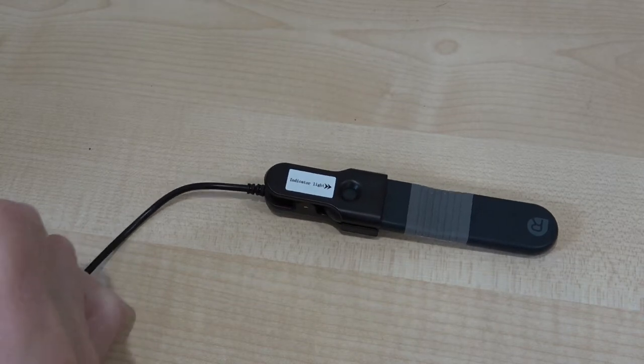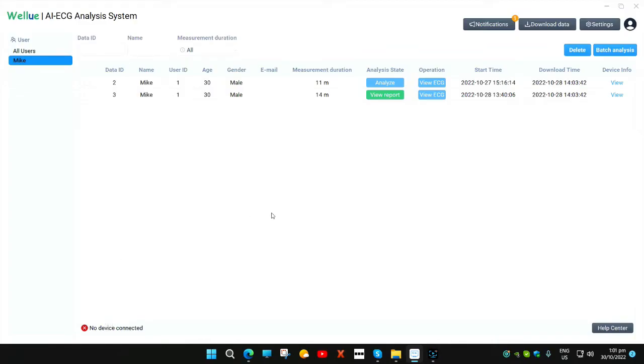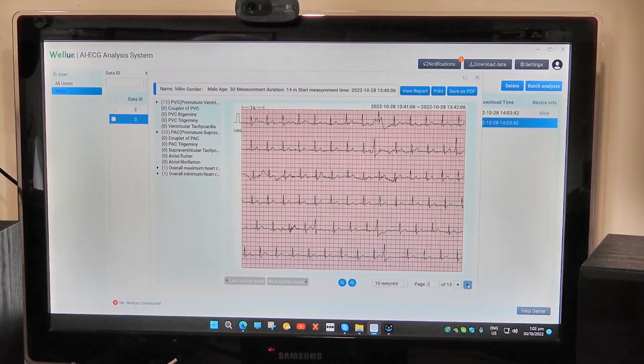We plug this into the USB power — in this case your computer — so it will do charging and also transfer the data. This is the screen you're presented with. You go to where it says 'download data', click on that, and this is what pops up. We're going to look at this report — I've clicked on that one and selected 'view ECG'. This top entry was just one where I was testing the software and is meaningless at this stage. This is the very first page where I was messing about with it, so generally the first page you can ignore.